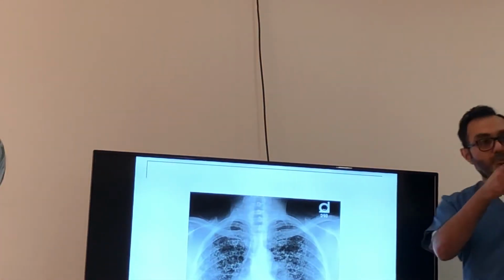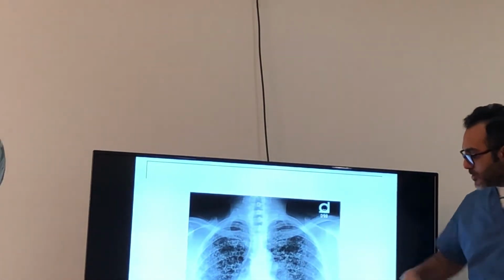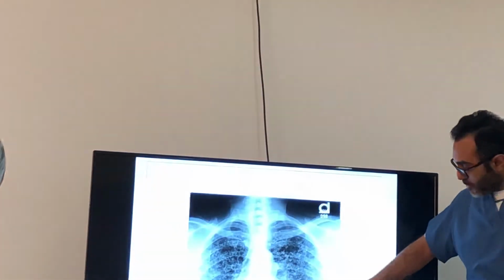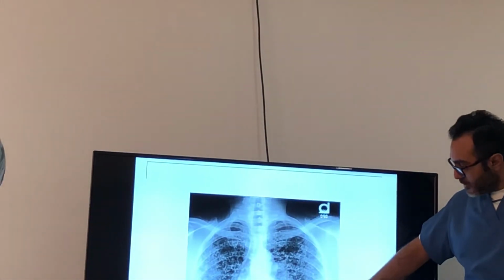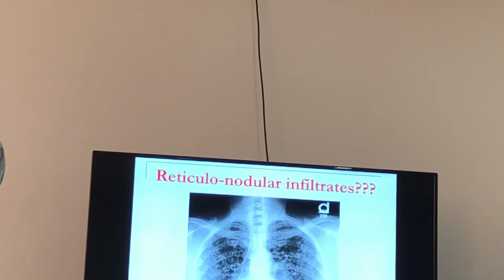As you said, it could be cystic changes. Early cystic changes, but honeycombing you can't say here. Possible here too. Or airway dilatation, because sometimes they get traction bronchiectasis, but we still can't diagnose by X-ray. You need to do HRCT imaging. So this is just to take other infiltrates, early cystic changes, for differential diagnosis of diffuse interstitial parenchymal lung diseases. All of them, not just one. Anything can do that. It could be sarcoid that's doing this. You don't know.